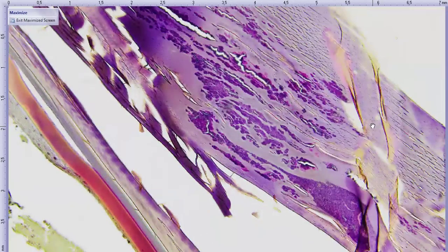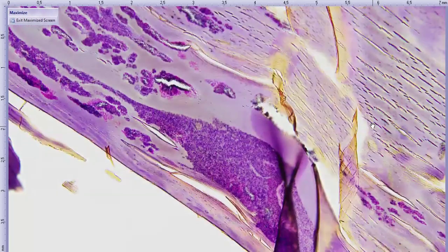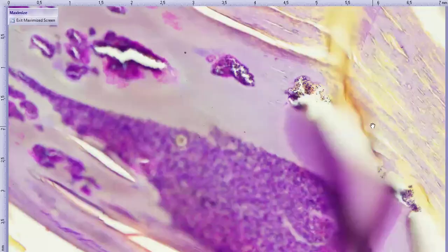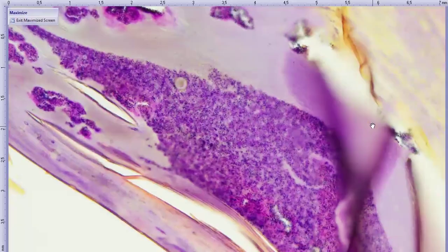So I was more skeptical of septic implantation syndrome, if nothing else, just because of how rare E. cuniculi is in dogs. So here's a gram stain. E. cuniculi organisms, or encephalitozoon organisms, should be about 1 to 2 microns in dimension, and then they stain positively with a gram stain.